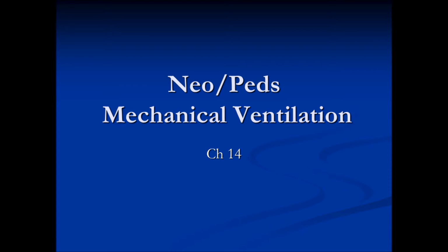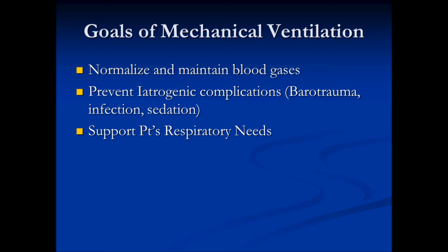In this chapter, we're going to talk about neonatal and pediatric mechanical ventilation. There are essentially three goals of mechanically ventilating a newborn or pediatric patient, really any patient, which is to normalize and maintain blood gases, prevent iatrogenic complications such as barotrauma, infection, sedation, and then to support the patient's respiratory needs.